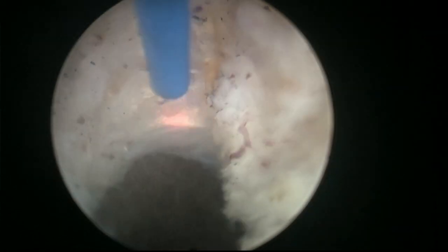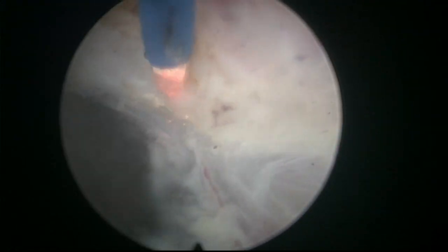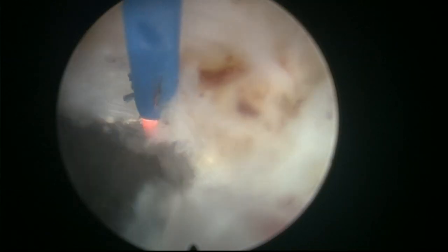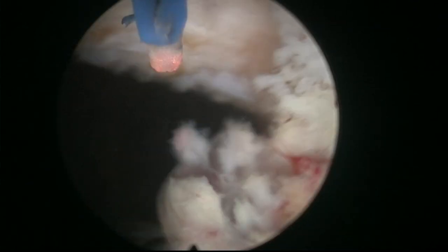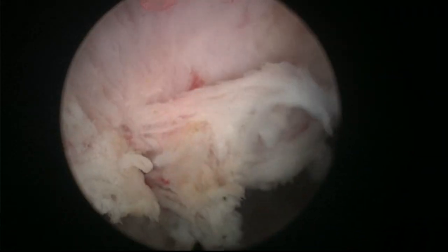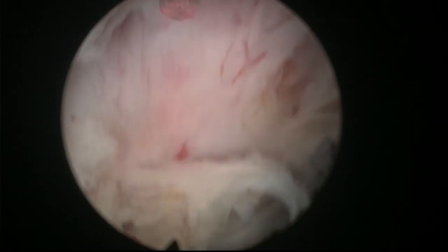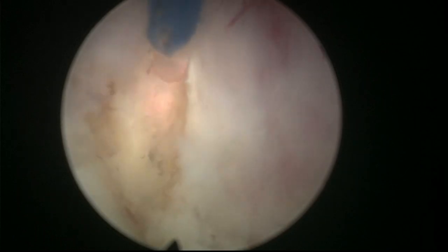Another trick: when you are here at the bladder neck, let's cut a little bit towards the side — if you do this, you're going to make your life easier for later. We come to the 12 o'clock region near the capsule and bring our incision a little bit towards the side. If we come down, we can almost come out and see the sphincter and the white line we marked. The next thing is to continue cutting all over the white line and connect it all the way up.